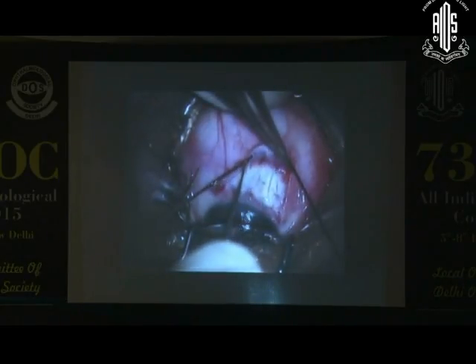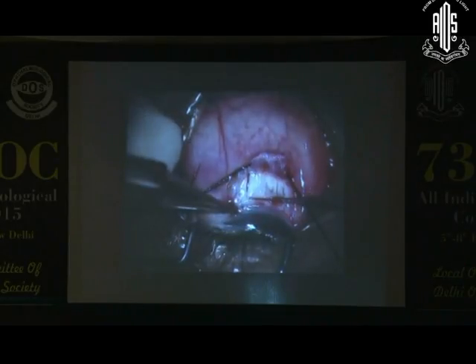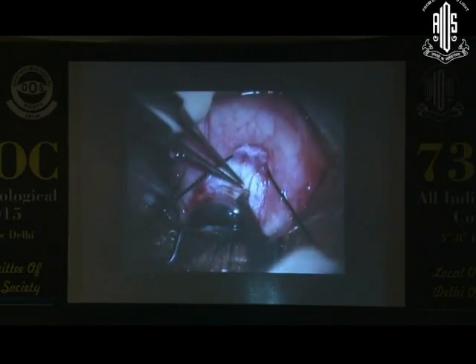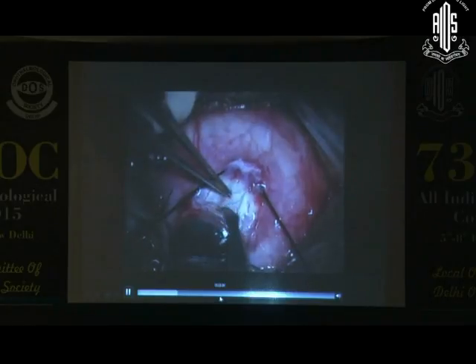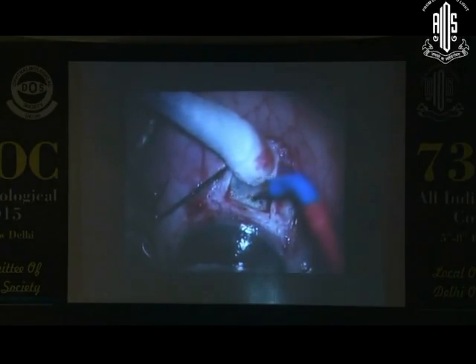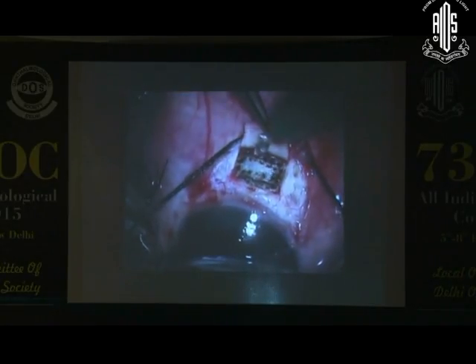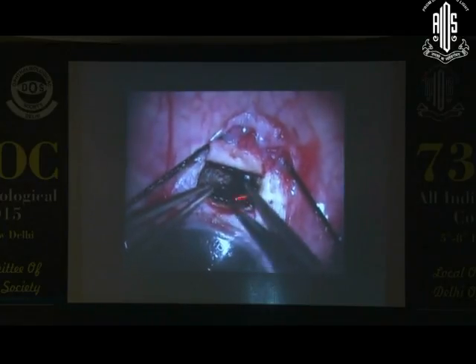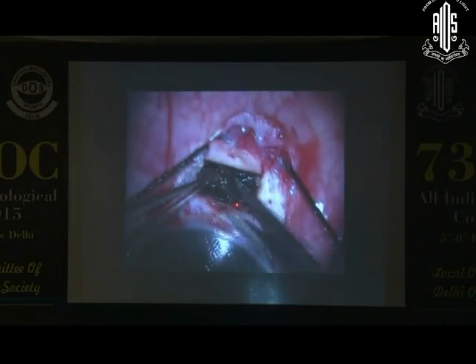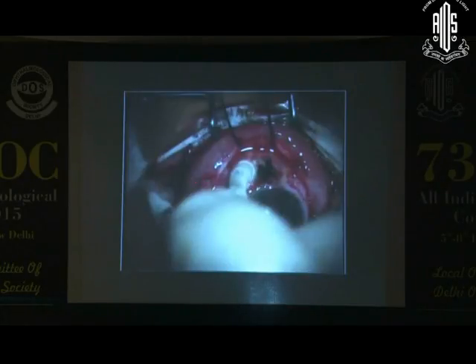This is a part of the steps of how we resect the tumor also. A trapdoor is created, a partial thickness scleral flap is created. Then diathermy to decrease the risk of bleeding from the ciliary body. And then the inner wall of the sclera is dissected out. And you can see the color of the lesion. This is jet black in color. So usually melanocytoma is jet black in color. So this was taken as a biopsy to confirm.